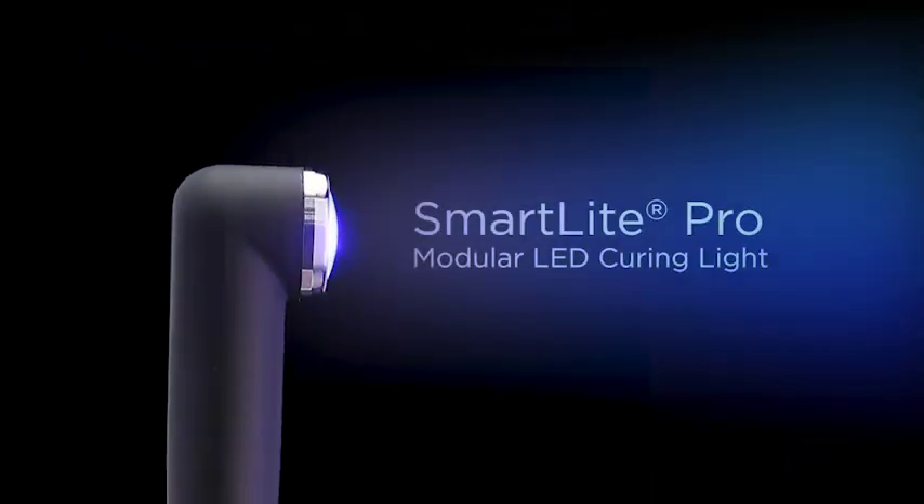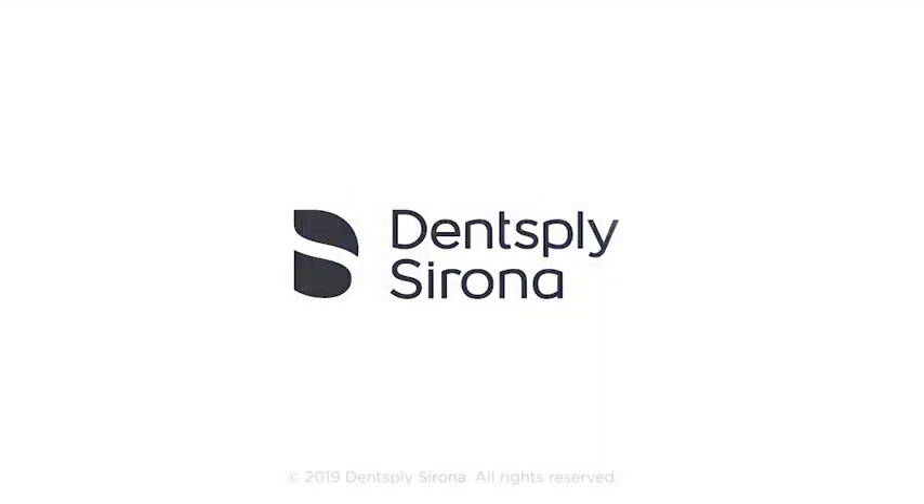SmartLight Pro. Clinical performance never looked so good. Ask your Dentsply Sirona representative for a demonstration.